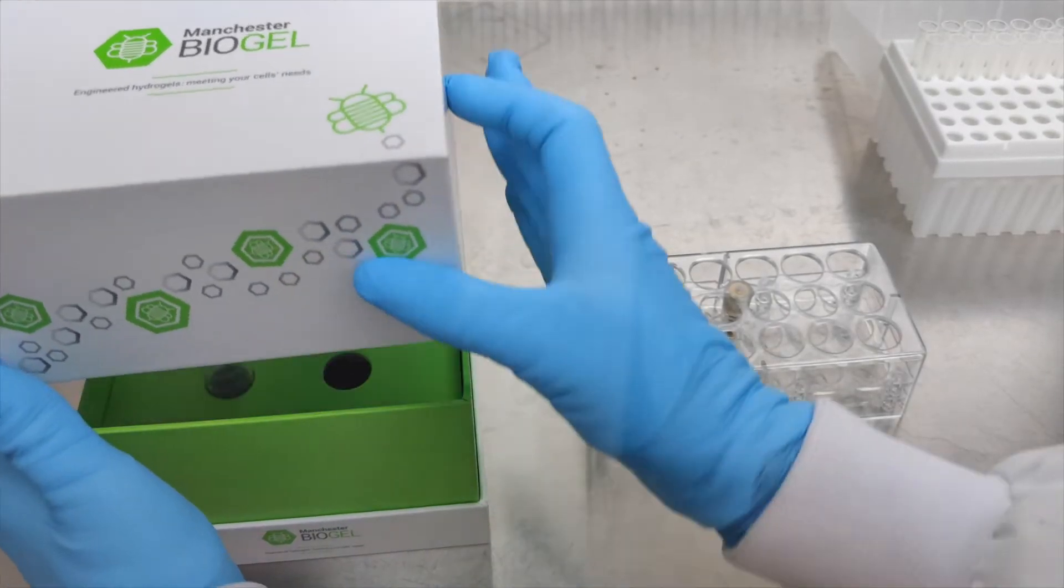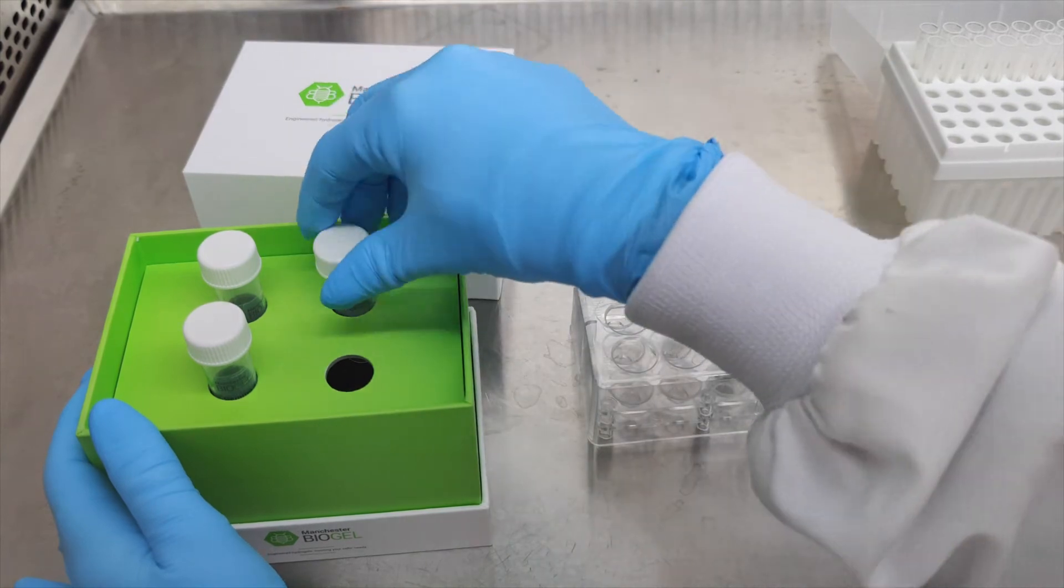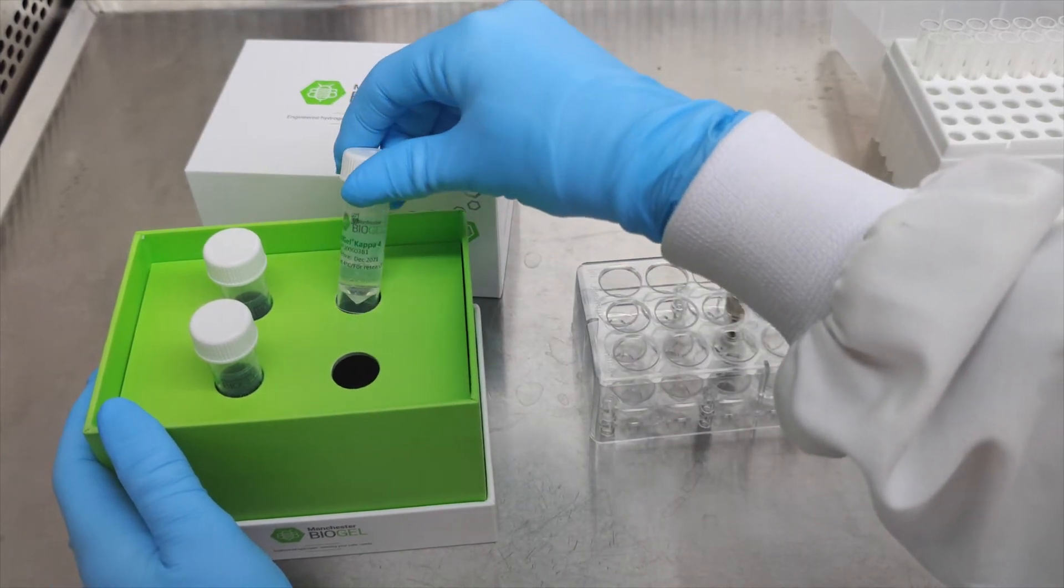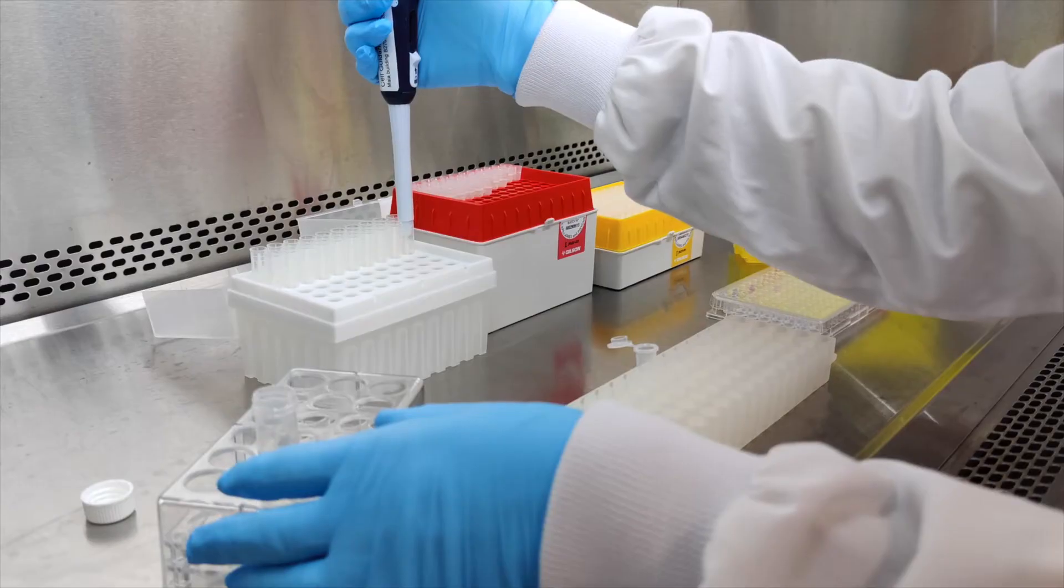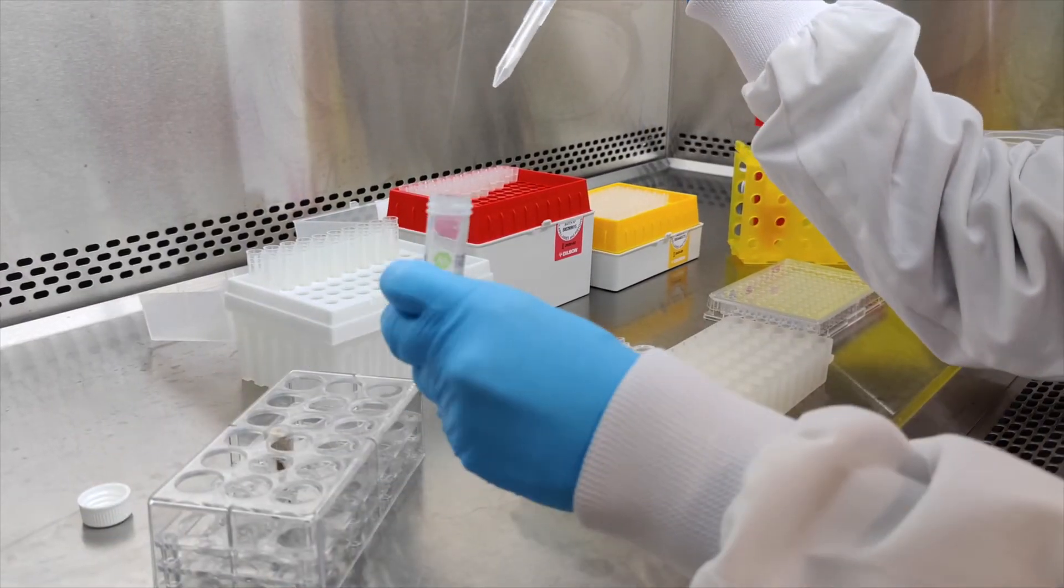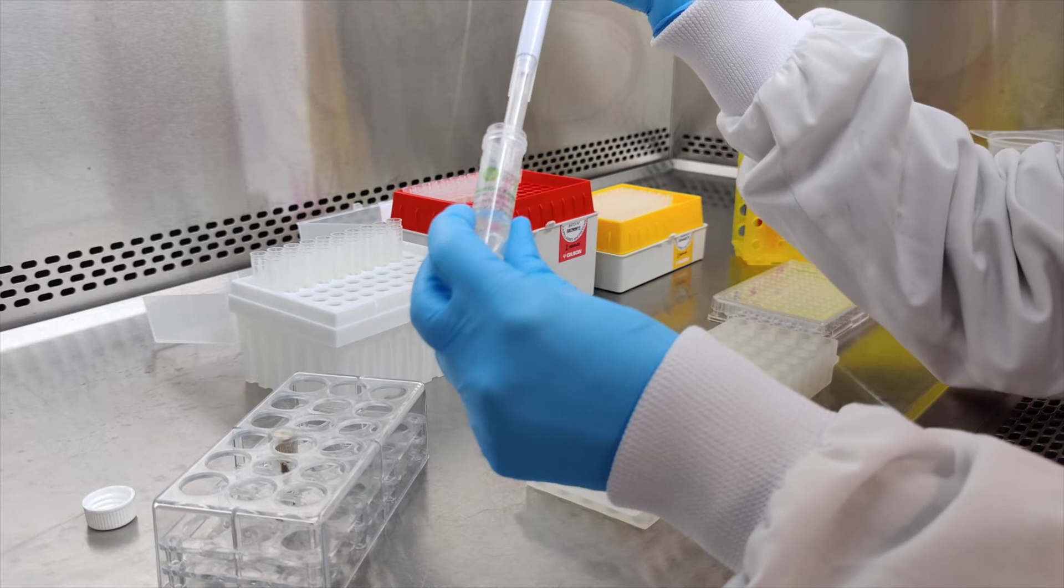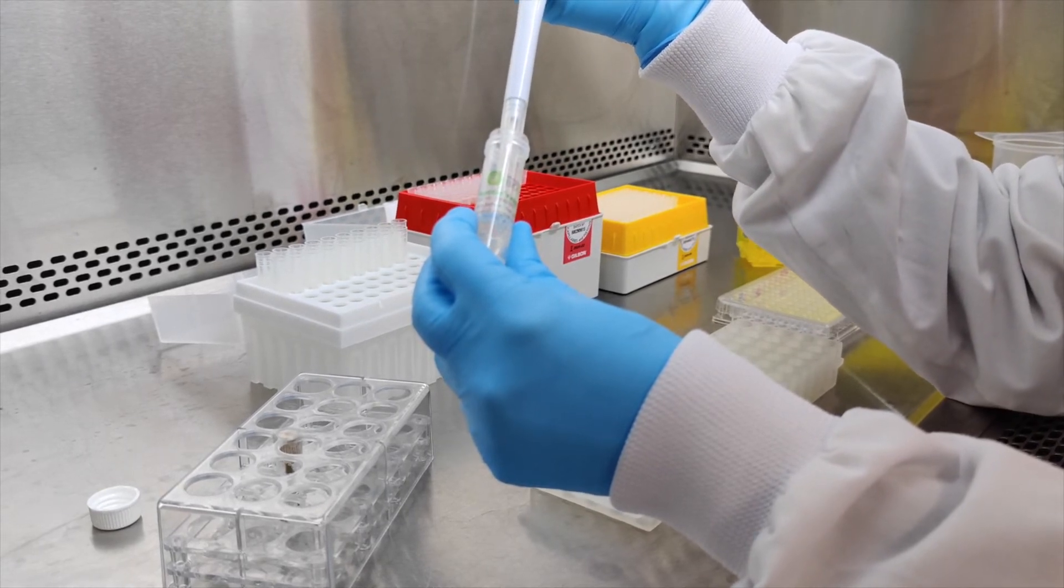Select which peptagel you'd like to use for your experiment. Allow peptagel to warm up to room temperature. Using a positive displacement pipette, transfer peptagel to a new microcentrifuge tube.